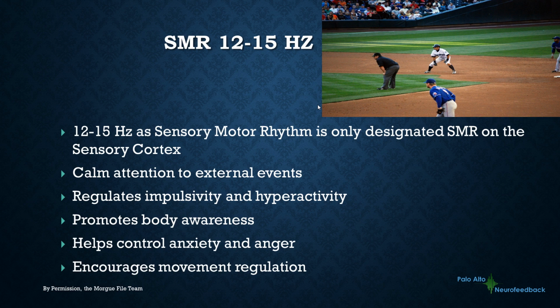SMR, or sensory motor rhythm, is 12 to 15 hertz. And this frequency is only designated as SMR on the sensory cortex, so it's in a particular part of the brain. If there is sufficient SMR rhythm, it looks like a calm attention to external events. It regulates impulsivity and hyperactivity, promotes body awareness, helps control anxiety and anger, and encourages movement regulation.